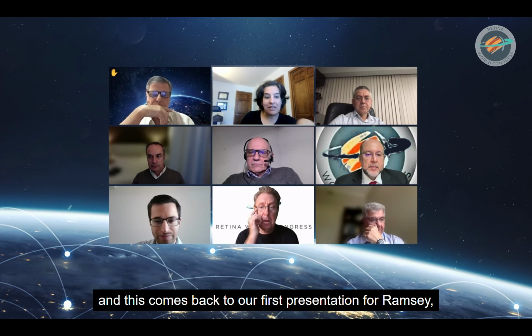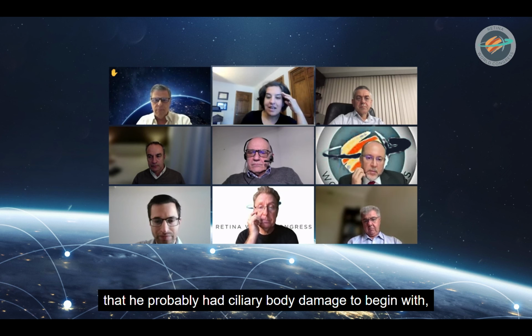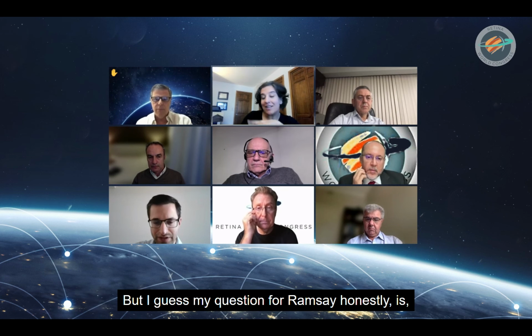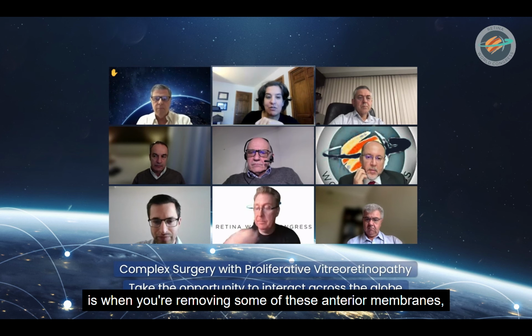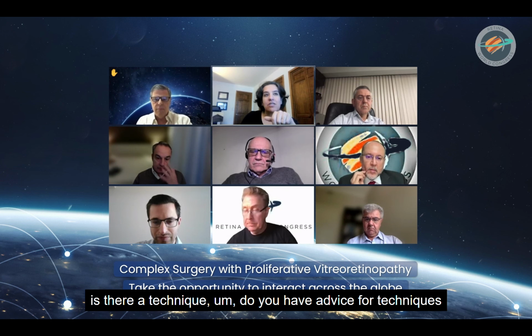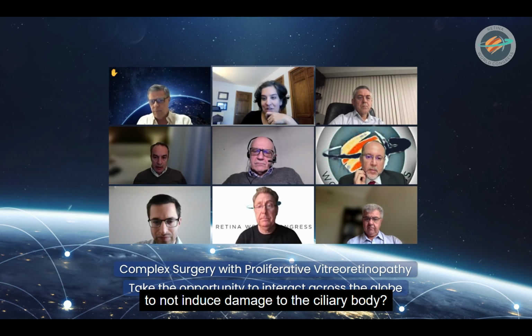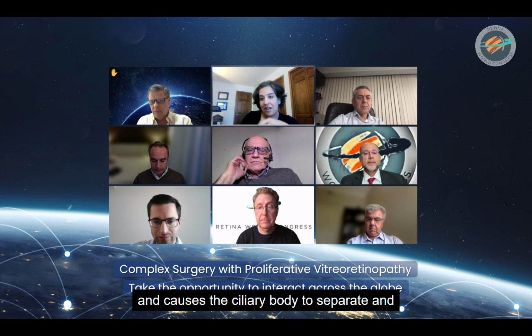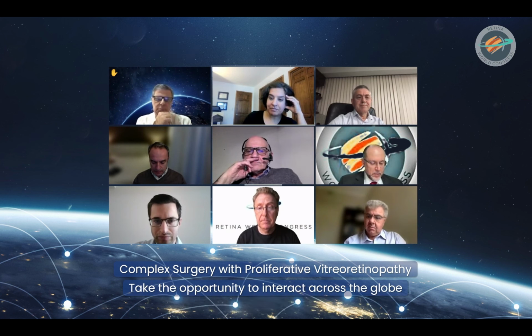So I suspect, and this comes back to our first presentation from Ramsey, that he probably has ciliary body damage to begin with. And what, if anything, could have been done during surgery? But I guess my question for Ramsey, honestly, is when you're removing some of these anterior membranes, do you have advice for techniques to not induce damage to the ciliary body? Because sometimes removing those membranes creates traction and causes the ciliary body to separate and or become damaged.